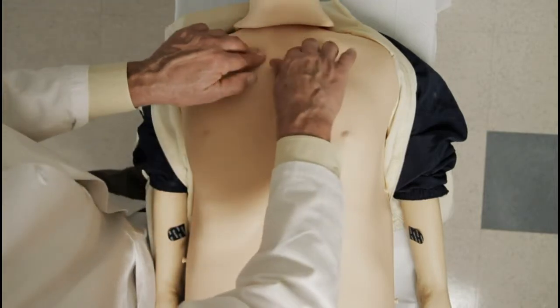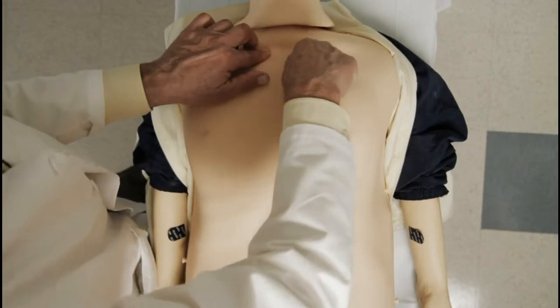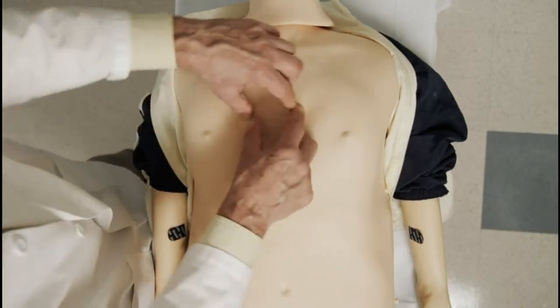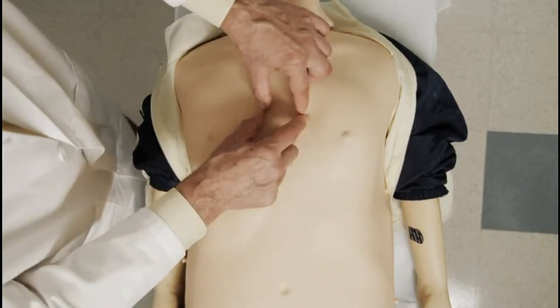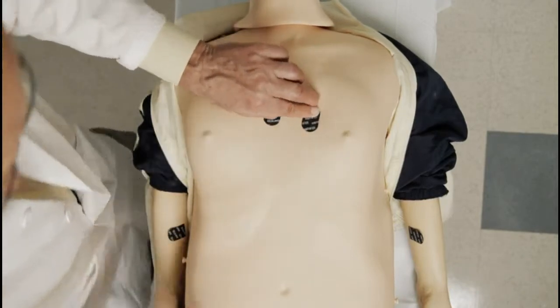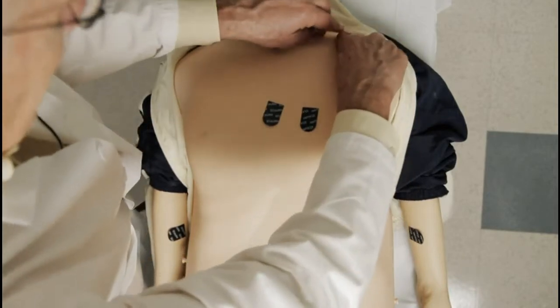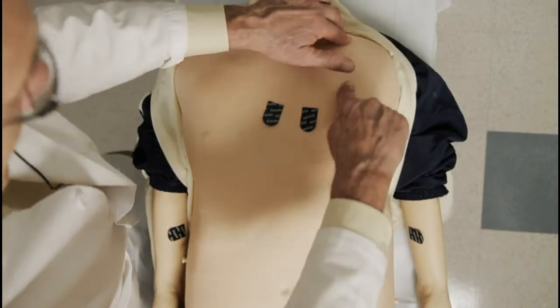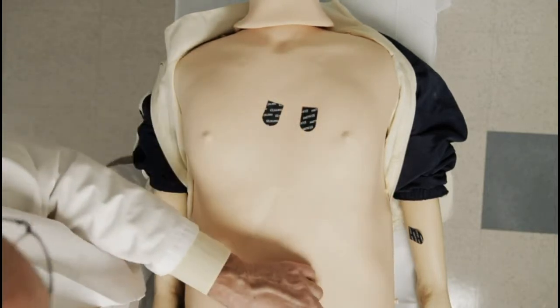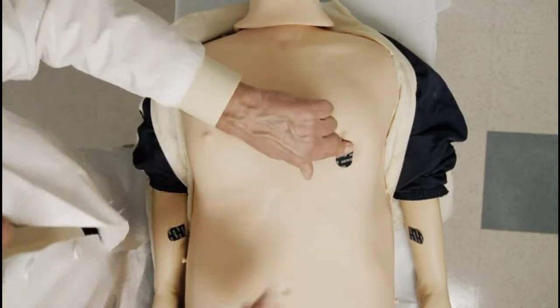Next, go to the chest and find the clavicle. Under the clavicle, the first space is the first intercostal space, the next is the second intercostal space, then third and then fourth. So on either side of the sternum, that's the placement for V1 and V2, with the tabs in the direction the wire is going to come. Go to the clavicle again, find the midpoint of the clavicle, and come on a straight line down to the fifth intercostal space — that's the placement for V4. These are the only precordial electrodes with anatomic locations.